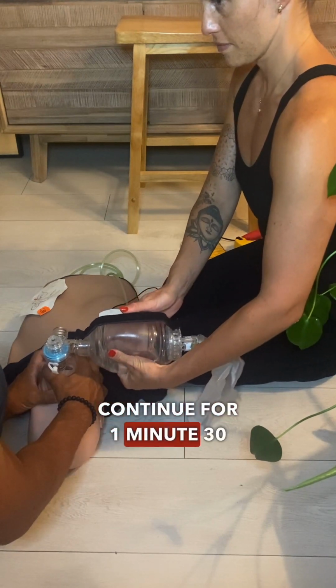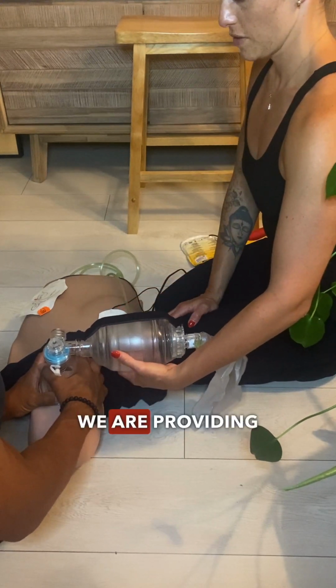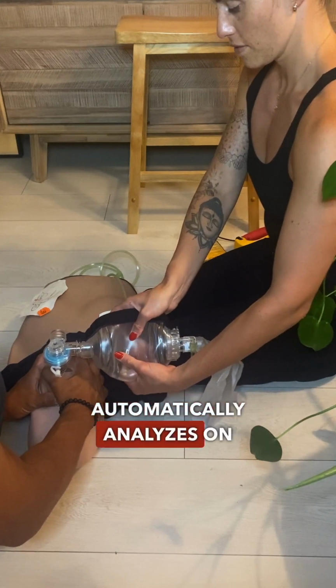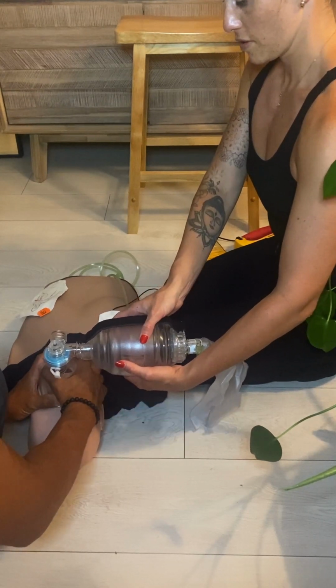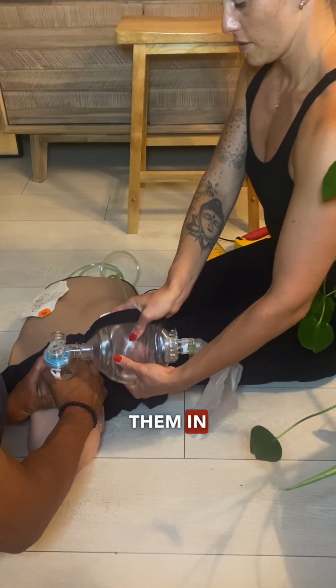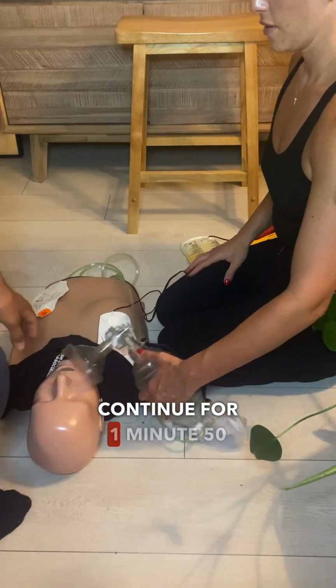Continue for 1 minute 30 seconds. We're providing assisted ventilations for the next 2 minutes once the AED automatically analyzes on its own again. Continue. Reminder, best case scenario, patient is breathing. Consider putting them in recovery position. Continue for 1 minute 50.